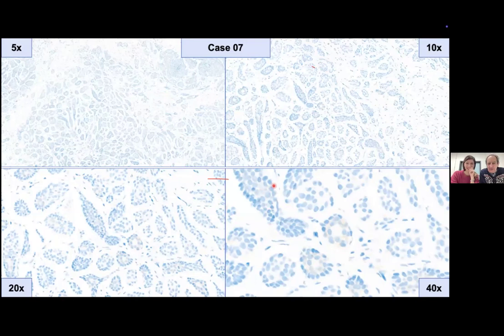Everybody score this. It may not be the last one, but no, it is, because we are at the time and we need to have the session on HER2 dual-ISH. Okay, so everybody here agrees 0, and maybe one or two thought it was ultra low.